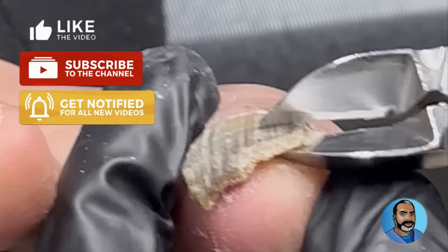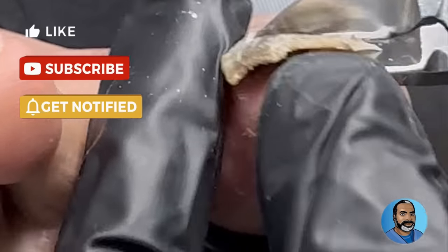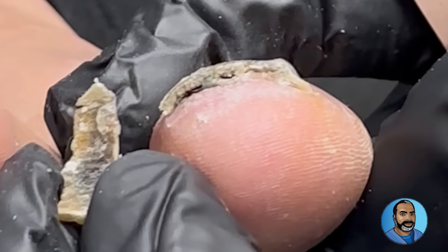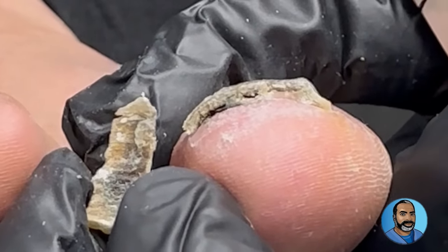Most of the time when patients come to me complaining of fungal toenails, most of the nails are all tinted. But every now and then I will see just one rogue nail. Here you can see the thickness of the nail, the discoloration, and the amount of buildup on the underside of the nail.